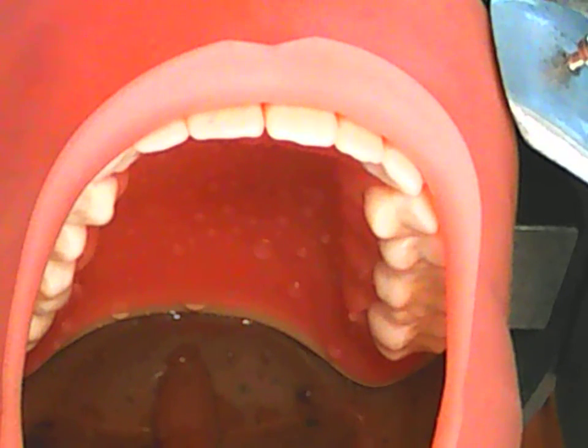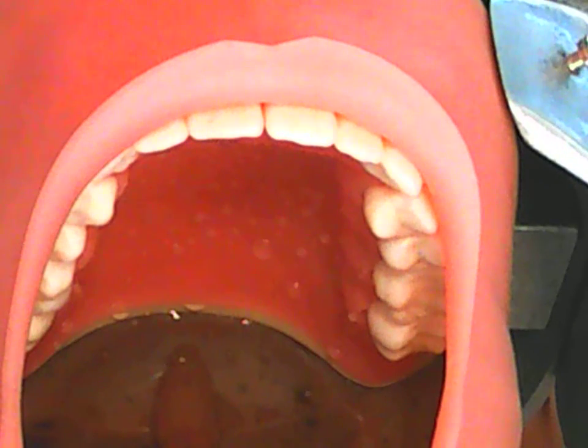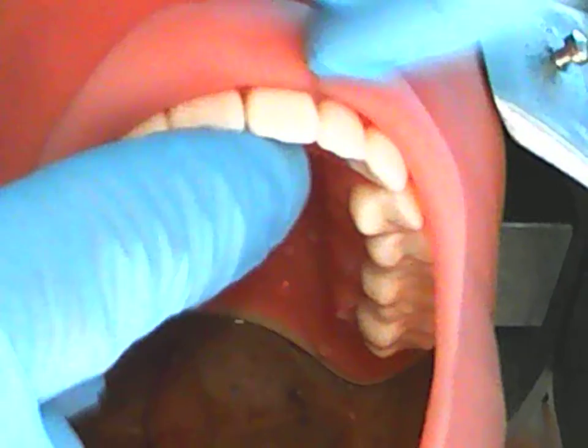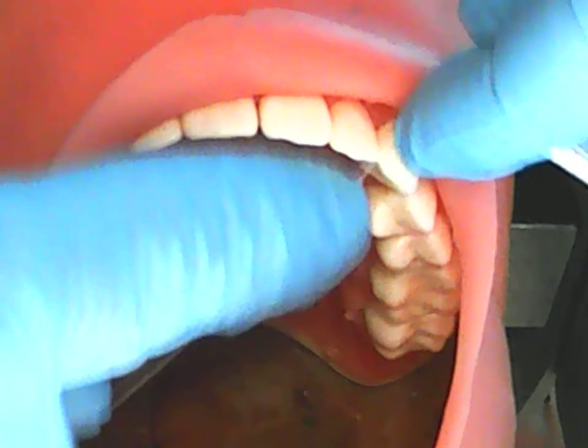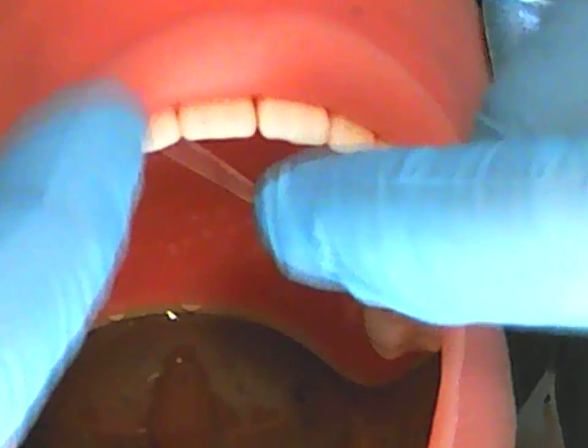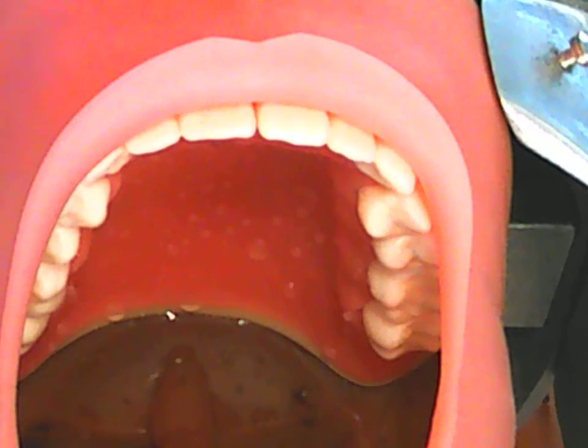So you have examined the treatment area. Perhaps there are crowns, bridges or restorative treatment that you want to become a little more familiar with. It's always a good idea to floss that area prior. We saw over here it's a little bit tighter, and nice loose contacts throughout the rest of your area. Good to know that you have one tight area that you may keep in the back of your mind for future reference.